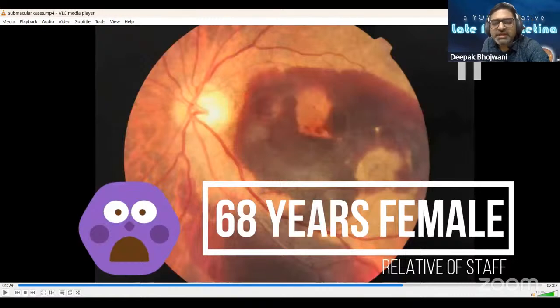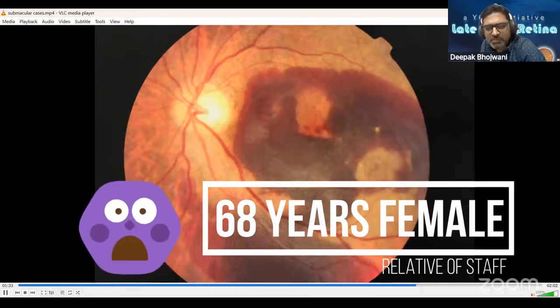This second case was an eye opener for me. This is an aged lady, 68 years old. She's a relative of my OT staff. She comes to me, coincidentally, having noticed poor vision for more than 1 month. For 1 month, she's been having this massive bleed in her eye, but she's reluctant for any surgical intervention. So I told her that we will not do any surgical intervention. We'll do just a pneumatic displacement to see how this hemorrhage is going to work.